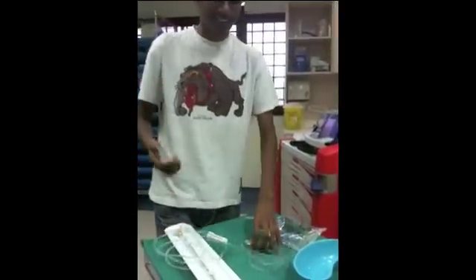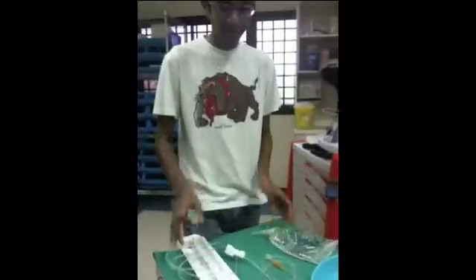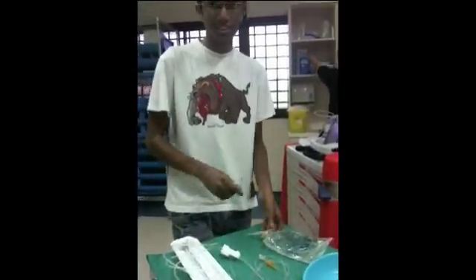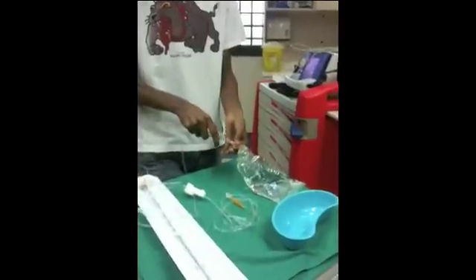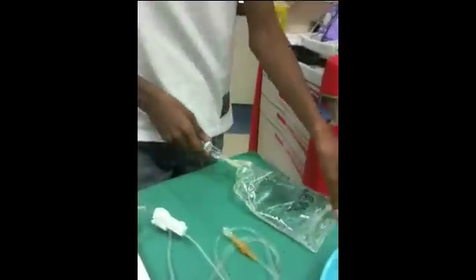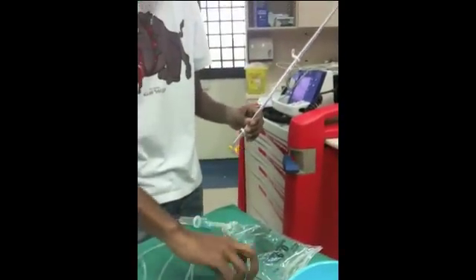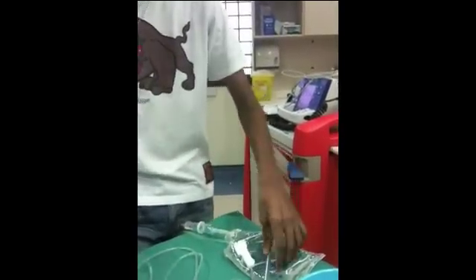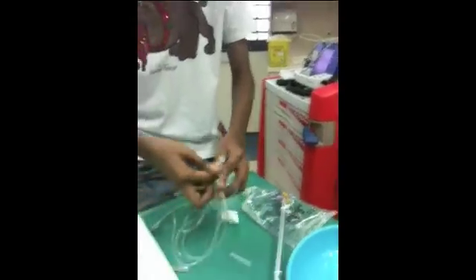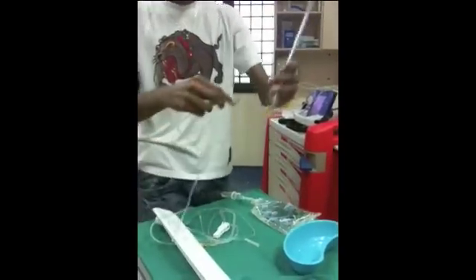Once everything is done, you must check the packaging and expiry dates so that all of us know. So let's start by spiking. Once we spike, I'll take out my roller clamp and I'll make sure the tubing is not coiled up — this is a big coil — and I'll prime it like this.